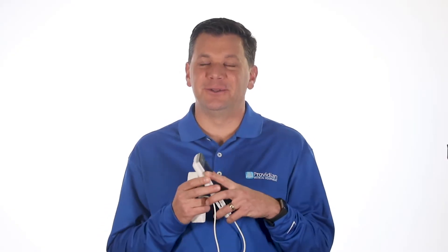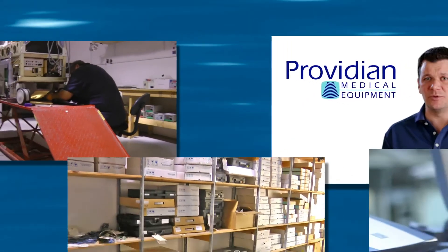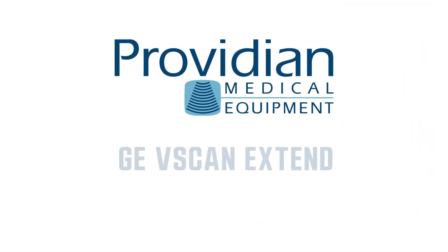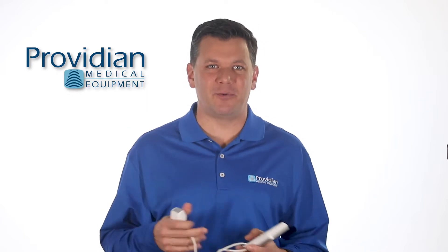The GE vScan Xtend — it looks really cool, but there's a problem. Hi, I'm Brian Gill with Providian Medical, and this is the GE vScan Xtend Dual Probe.